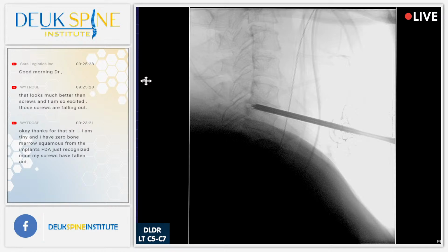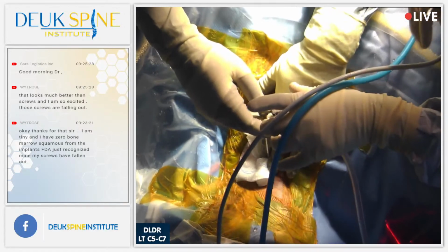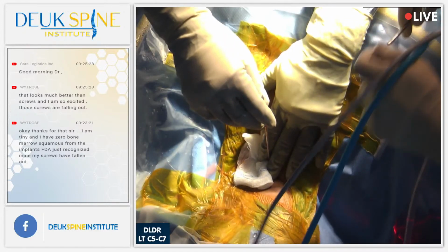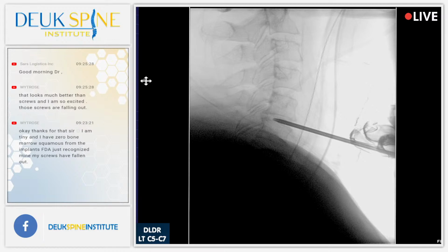First thing I'm going to do is take this tube out, and then I'm going to leave my dilator. So I put the dilator back, taking the tube out. You all see that shot? Now I'm going to move this dilator out of the disc, and I'm going to move it to the next one down. All right, let's get started. We need a little shoulder action, a little inline traction, head straight. I need my team helping me, and I'm going to move this thing out of the disc and to the next one. Shot, I'm out.